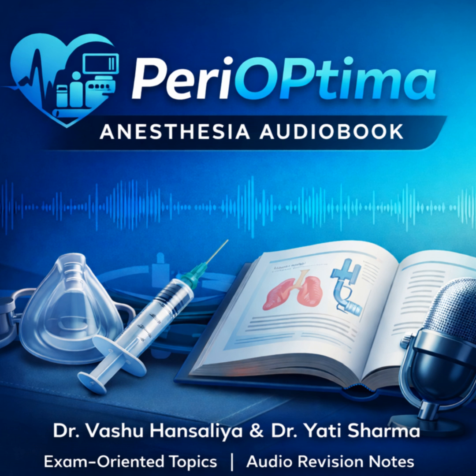But the disadvantage has to be the mirror image of VCV's problem. It's the perfect mirror image. I call it volume volatility. Because you've set the pressure, the tidal volume is now variable. It completely depends on the patient's lung mechanics. So if their lungs get worse. If their pulmonary edema gets worse overnight and their compliance drops, that same 20 centimeters of pressure that was giving you 500 milliliters of tidal volume yesterday might only give you 300 milliliters today. And unless you have your low volume alarm set very carefully, the patient can silently hypoventilate. That's a critical point.